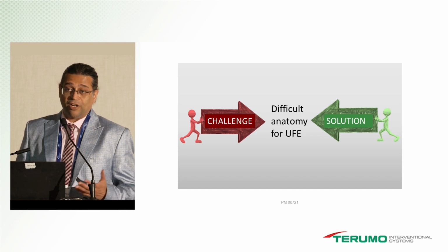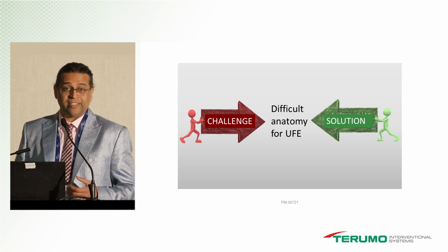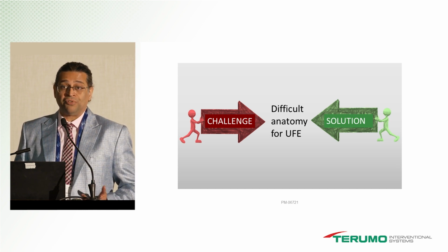Coming back to tools, a lot of things have advanced in the last few years. When we started this in 2015, there was a SARA catheter, there was a ProGrade that was not even 150 cm, probably at that time it was 110, 130, and now we have a vast range of products available that you can use for successful cannulation.